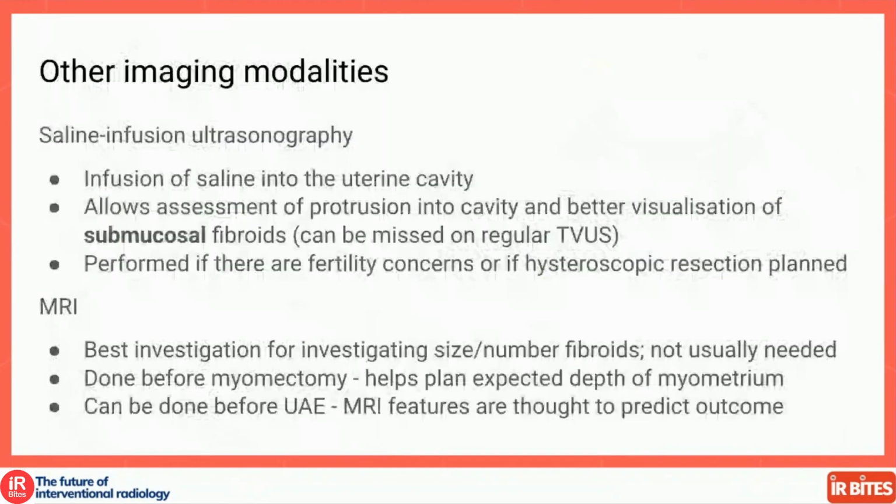In terms of other imaging modalities, the one I'd mention is saline infusion ultrasonography. What that is, they infuse saline within the uterine cavity and then rescan them.